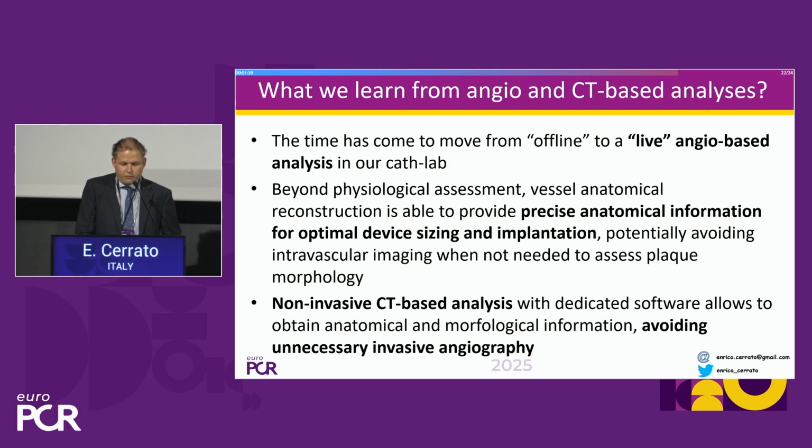So what do we learn from angio and CT-based analysis? We can see that basically the time has come to move from offline to live angio-based analysis that could be implemented in our cath lab in nowadays practice. Beyond the physiological assessment, a methodology like QFR could also provide some anatomical information that could help in optimal device sizing and implantation, which could be especially important in patients that have to implant a resorbable scaffold, to correctly size the vessel.